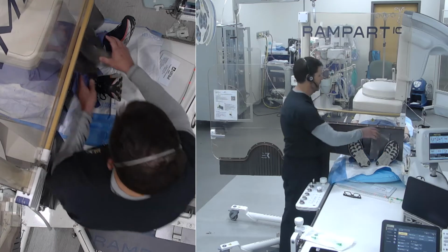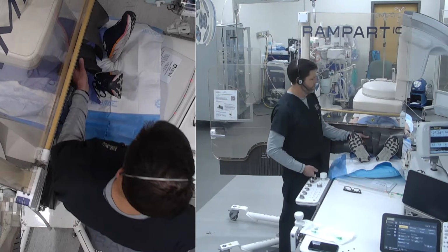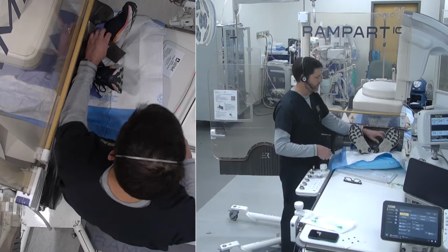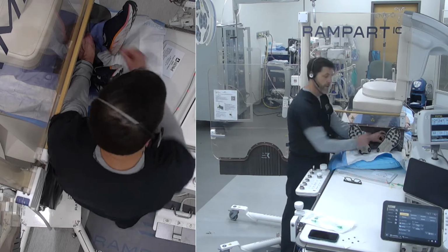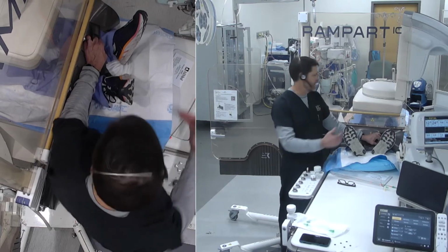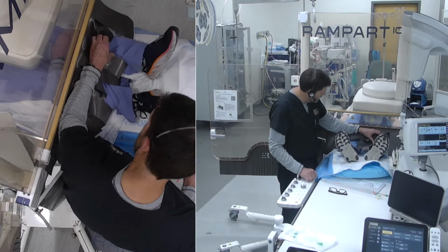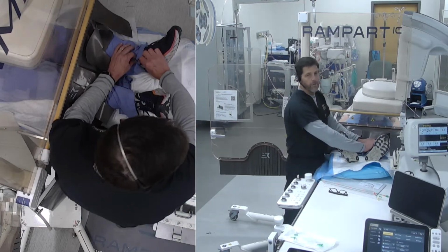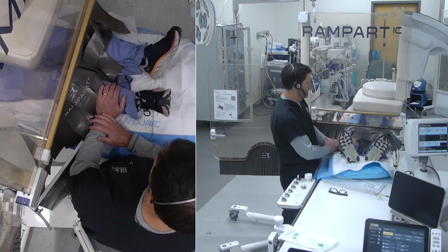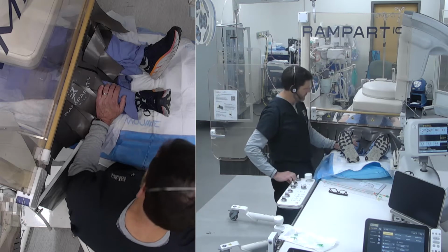Again, when you do this, as you move down, you'll want to either raise the table so that it lowers your gap here. Okay. Get your soft shielding, and then you have your access right there at the ankle, and you can work anywhere in the leg. I do a lot of pedal cases. Fixing SFAs works great for that, because then you're working like right there is where the SFA is. Your ankle's right here, and so your tibial vessels are really easy to access with the lower extremity panel going straight across at the shin level.